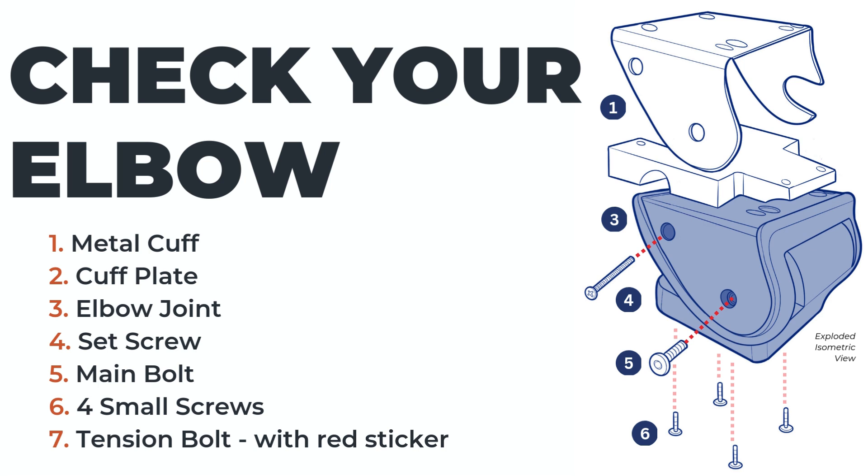Make sure that your elbow has all of the listed componentry. You will also receive four additional longer screws in case you find that you need them. Identify your tension bolt — this is the bolt marked with a red sticker. It is imperative that you do not unscrew this bolt at any point during the process.